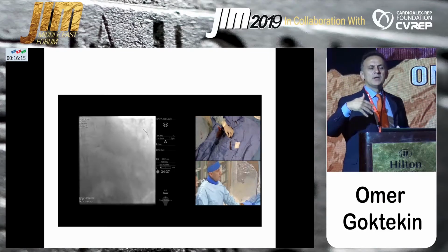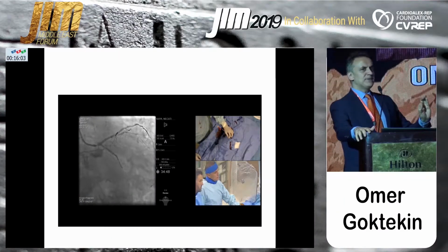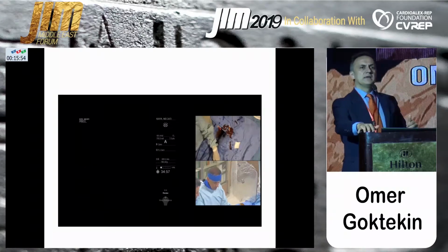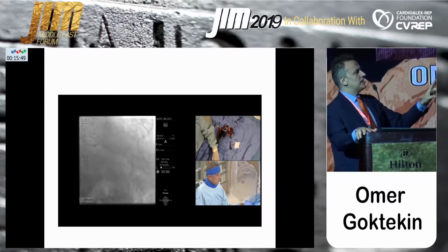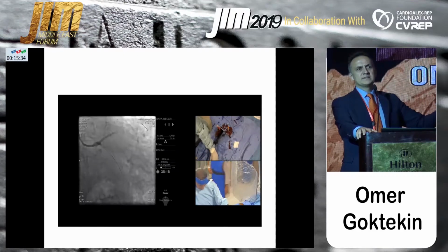If I send the Pilot, I let the wire go until it stops. If it stops, then I have a microcatheter and I do more fine work. But sometimes Pilot 50 or any XT or any hydrophilic wires find their way and go, sometimes in seconds, to the distal. In this case, I needed the support of a microcatheter. This is the microcatheter, a Fine Cross. You see, it wasn't that difficult to go distal.